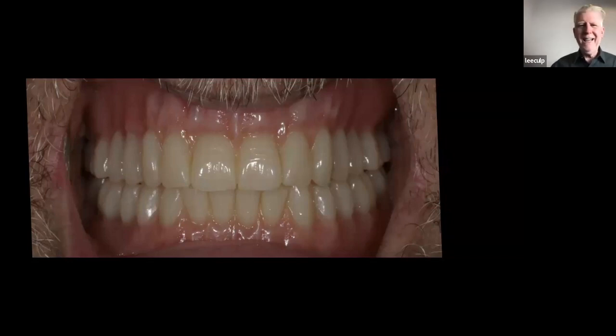Regardless of anything else that we do, and it all depends on your impression, how good your impression is, just like a crown, good impression, you get a denture that fits so well you can hardly get it out of the mouth. Same thing on the lower. That's where we have most of our retention problems, but again, we get very retentive lowers also. But the fit, patient satisfaction, sore spots, all those things are alleviated way, way down. So patient satisfaction is really through the roof because they're just not coming back, and you're not spending your time with them coming back every week, spot here, spot here, spot here, putting the marker in, trying to figure it out, and going through all of that process.